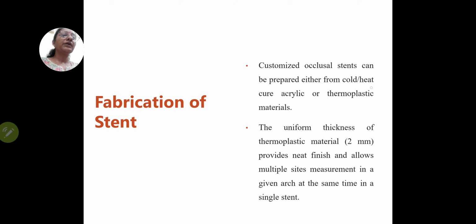Fabrication of the stent is very simple. It is done either by cold or heat cure acrylic or a thermoplastic material with a uniform thickness that is maintained by use of thermoplastic material of 2 mm, and we get a neat finishing.